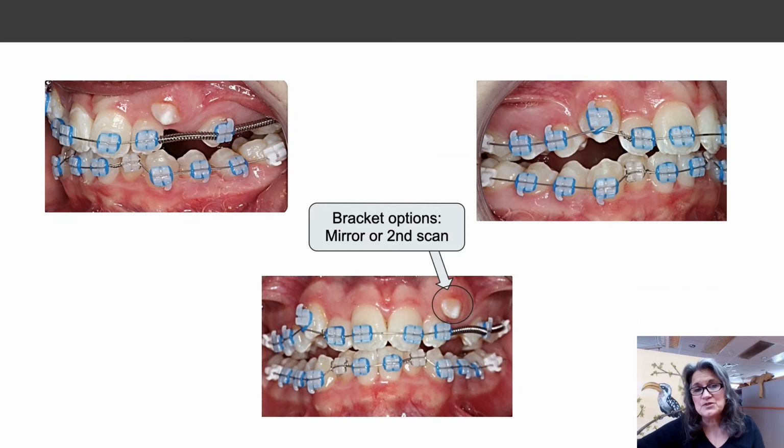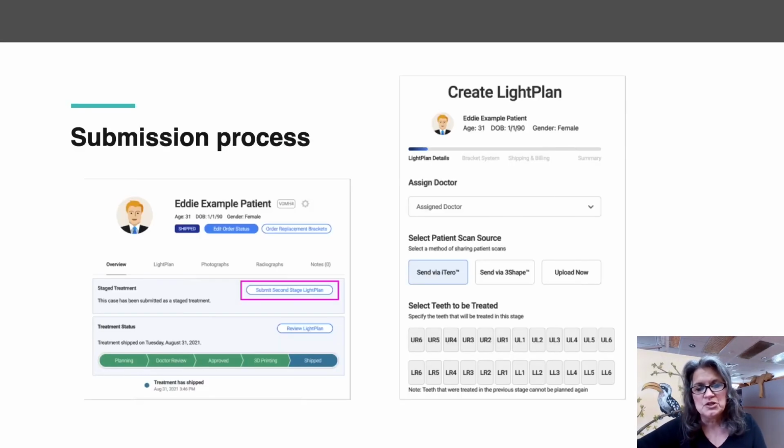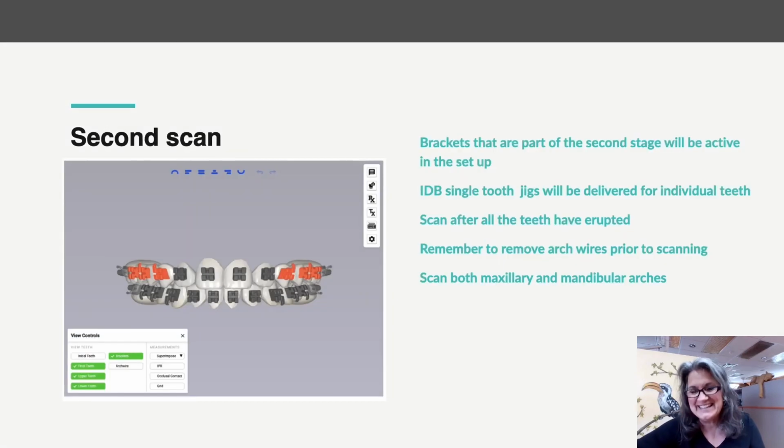So what are my options when I'm going to be adding brackets? Well, they can mirror the bracket from the opposite side, or you can create a second scan. So with that second scan, there's going to be a submission process, and you're going to be able to tell them which teeth you're going to be adding. Now, there's just a few things I'd like to share about that process. Now, the brackets that are part of the second stage will be active in the setup. You're going to see those in orange. The gray ones are ones that were moved previously, and you cannot manipulate those.